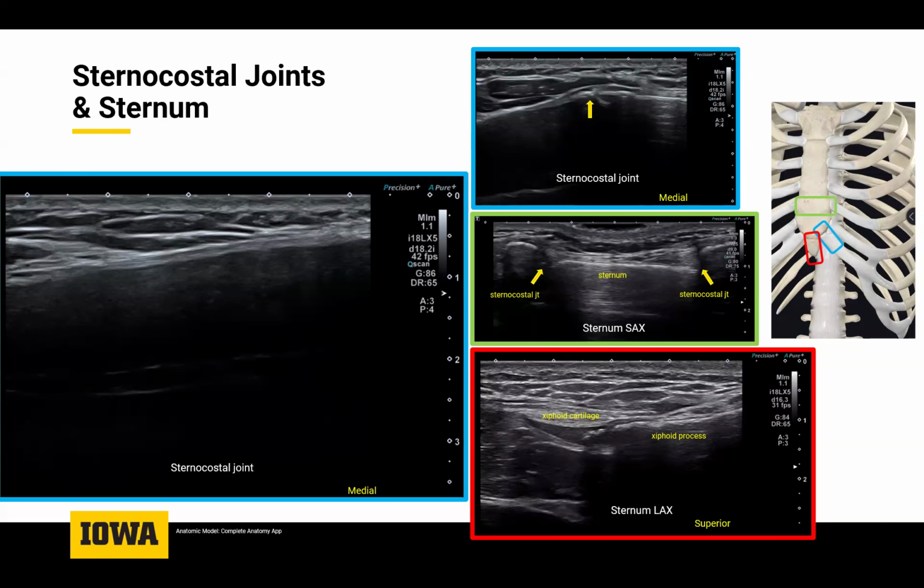But when it comes to traumatic rib injury like you have, ultrasound is fantastic. It checks all the boxes. You can correlate with clinical findings. It's a superficial structure. It has variable planes that you can adjust with your transducer. You can get comparison views. And so I would say in the majority of time with traumatic rib pain, we're able to utilize ultrasound to help us with the diagnosis, as you suggest. And I've occasionally used an intercostal block in these situations, with a rib fracture. I try not to do too much of that, but I have utilized it.